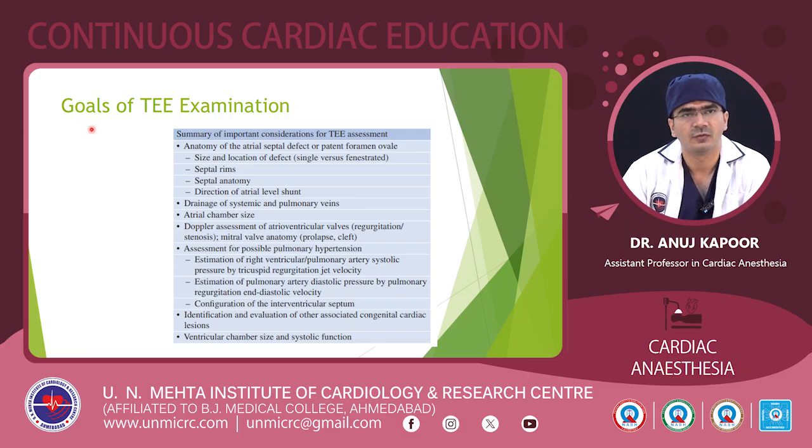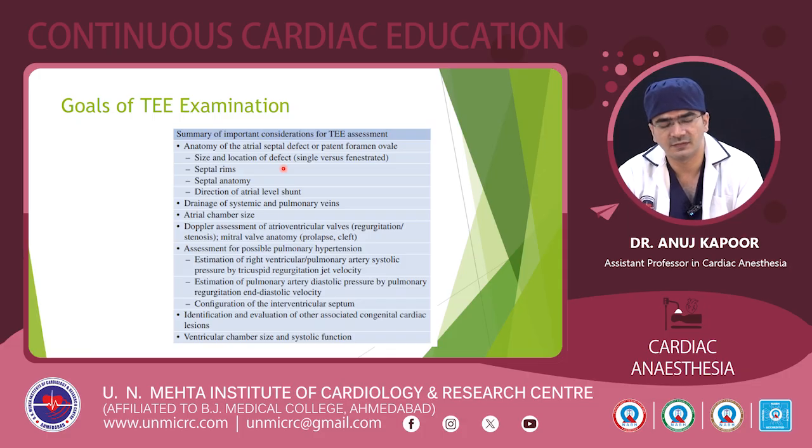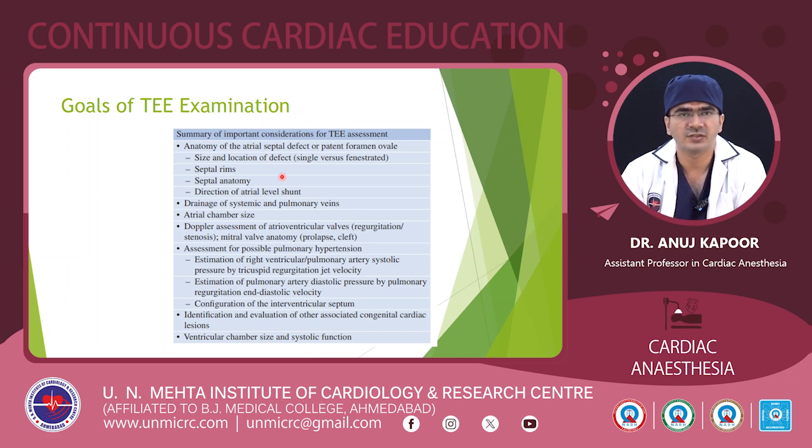We will now look at the goals of our TEE examination whenever we are doing a TEE examination. So what would be our goals for that? First of all, the anatomy of the atrial septal defect or patent foramen ovale. Here we have to assess the size. The size is important as the larger the ASD, there are more chances of development of PH, and the location of the defect. There are various types of ASD as we will discuss in the further lecture: ostium secundum, ostium primum, sinus venosus, and coronary sinus types of defects. So we will have to confirm which type of defect it is, and we will have to see if there is a single defect or multiple defects.